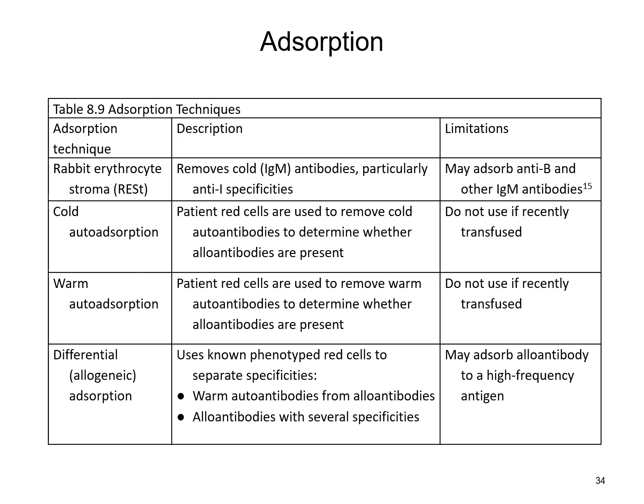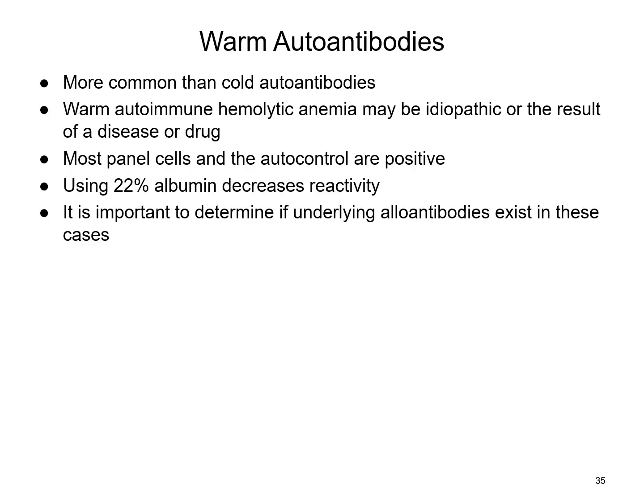Again, it's a very complicated process and procedure. Not likely you're going to encounter it. Just know that these absorptions are what these larger reference labs are going to do to work up some of these more complex cases. Now, your warm autoantibodies are more common than your cold autoantibodies.